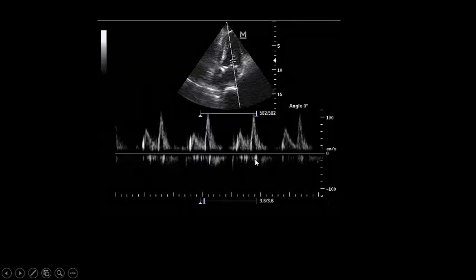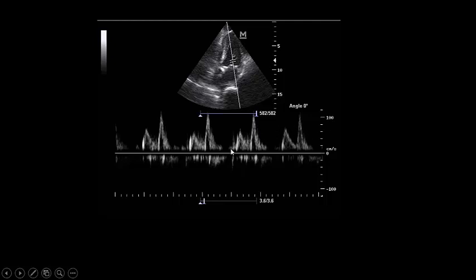In a period without arrhythmia, as you see here, the E wave is less than the A wave, and almost 50 cm/s or less than 50 cm/s — this is consistent with grade 1 diastolic dysfunction.